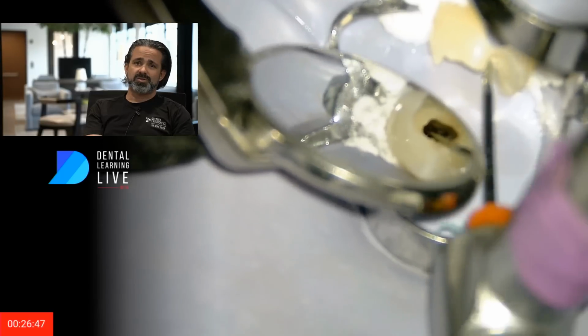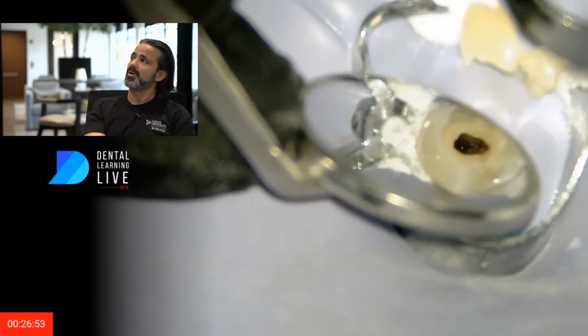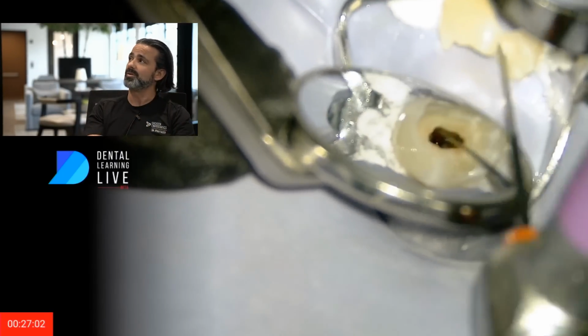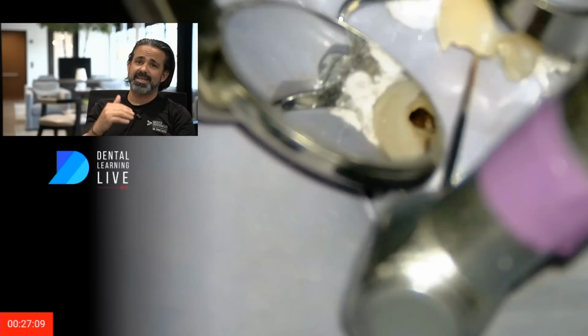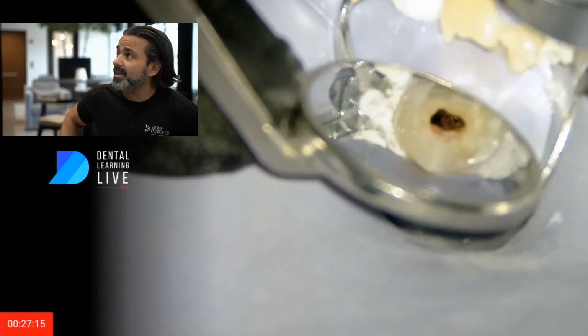And I use the calibrated marks. So when I'm looking at it, I'm actually looking at the marks on my file, and I'm taking them down to those marks as a reference point, as opposed to measuring on a finger ruler or just a hand ruler. And if you can remember, go back and watch it before, I'm getting to length now. And I'm not feeling that tight bend. It's fairly open. And that's great.